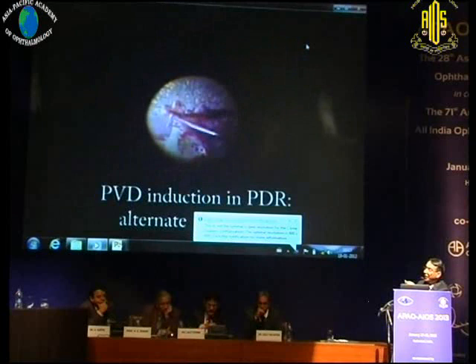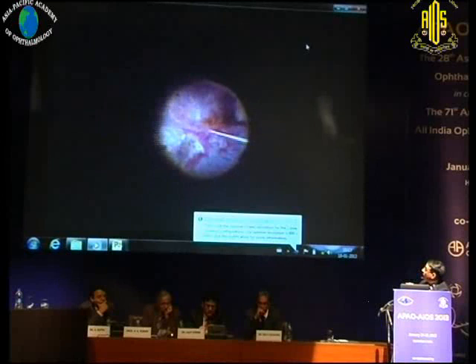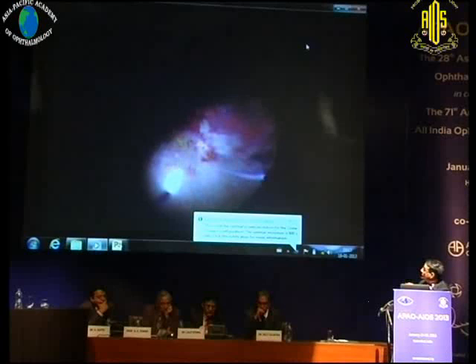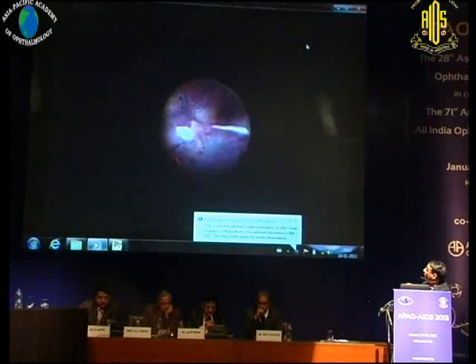This was an interesting case — the advantage of operating on active disease is that here you can induce a posterior vitreous detachment almost as you would in a classic macular hole case. The hyaloid came off nicely, though you're generally not so lucky in most cases. When the posterior hyaloid separates cleanly like this, such a case can finish quite fast. It was already well lasered, so there was not much to do after this.